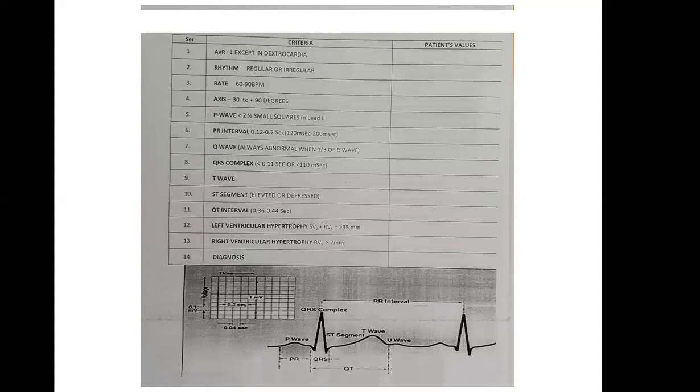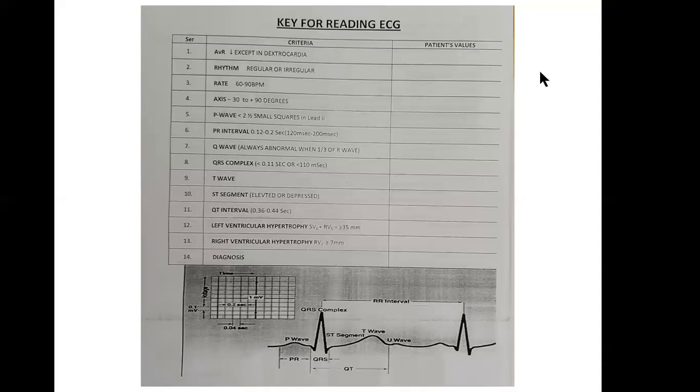And secondly, when you are doing pre-anesthesia assessment, ECG is important. Below 40 years, if there are symptoms of cardiovascular disease, you can order ECG. But after 40 years, it is essential to do ECG and to pick any abnormality in the cardiovascular system. And these are the points which we will discuss in the following slides.